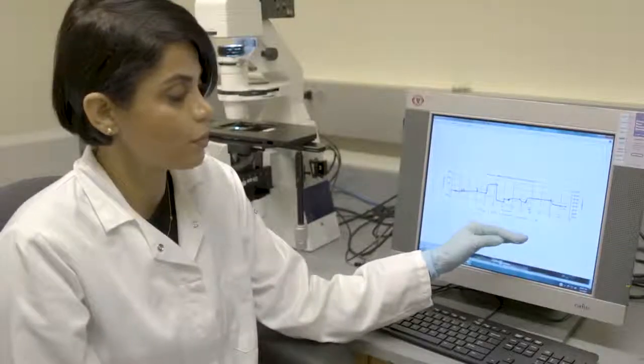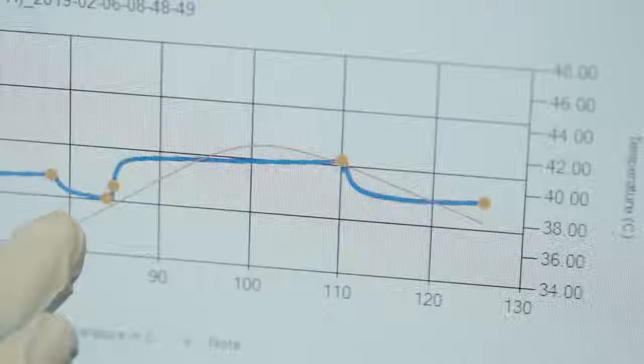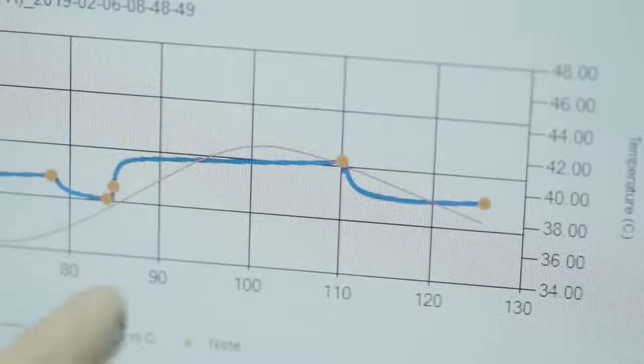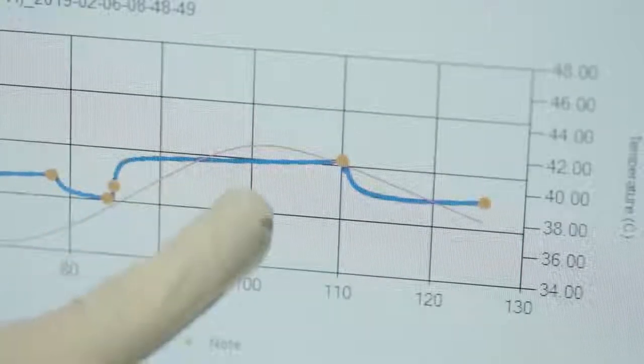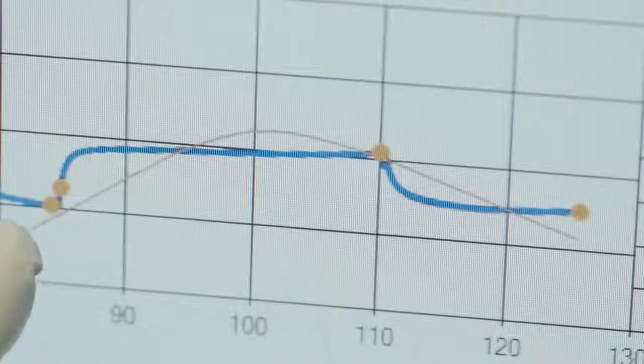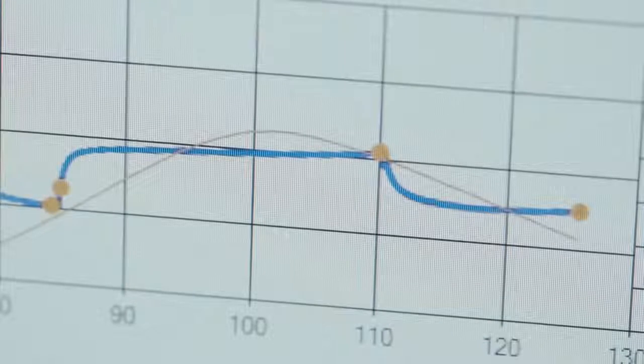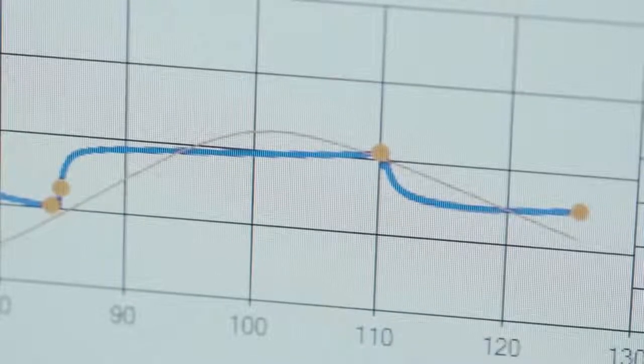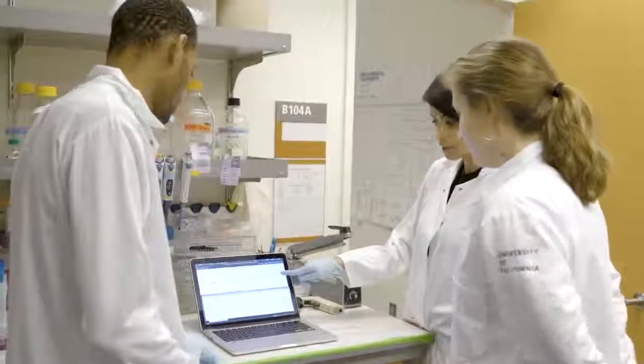This shows you the response that we get from CRISPR chip. Here, you're looking at when we actually introduce our DNA sample and remove it from the sensor. This endpoint, if it doesn't match this initial point, that means that our CRISPR chip was able to detect the gene that we programmed it to detect. This is a DMD sample.